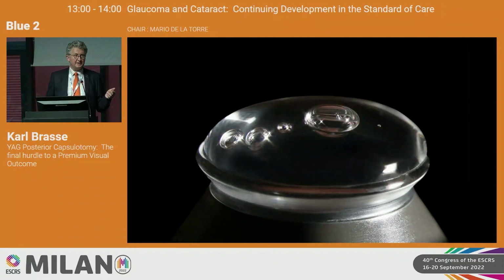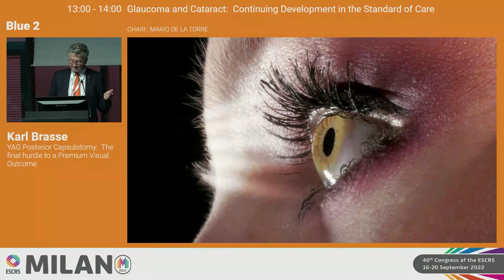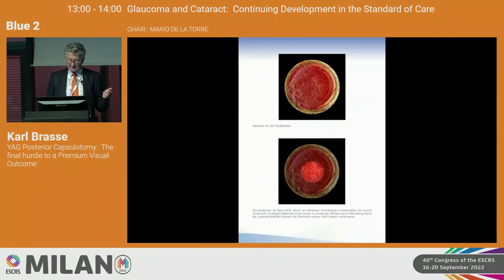If you do the treatment, air bubbles have to be avoided. Yeah, this looks nice, but I tell my patients it's better to leave it when you come for laser treatment. We have now new lenses. The upper image shows you PCO and a slit lamp. The lower one shows you the image with an Abraham contact lens.